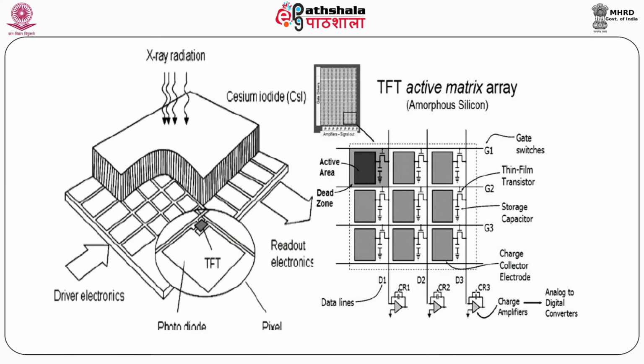The time varying analog signal is processed for amplitude, scaled and compressed. Sampling and quantization takes place. Further, the imaging plate is erased so that it can be reused for another exposure without any ghosting.